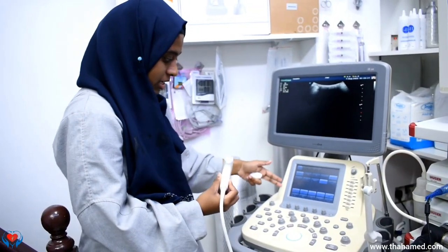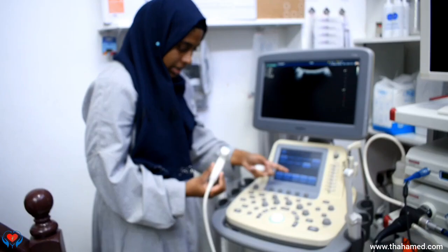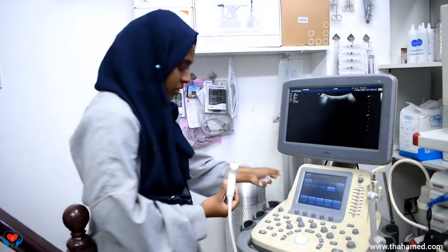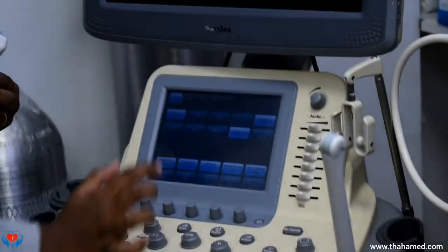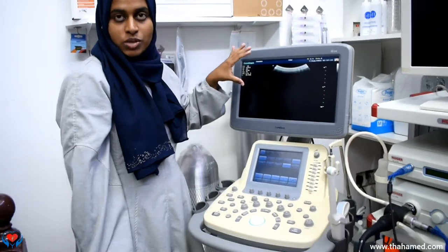There are some other keys displayed here, that is frequency, chroma, like that. If the patient is very fat or obese, we are going to reduce the frequency. So I can select the frequency and then adjust. This image which we are seeing is the basic image, or B mode image.